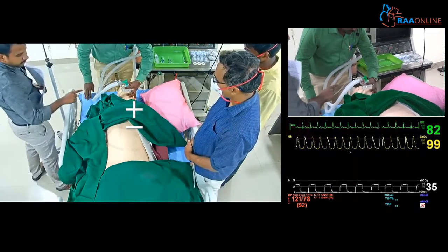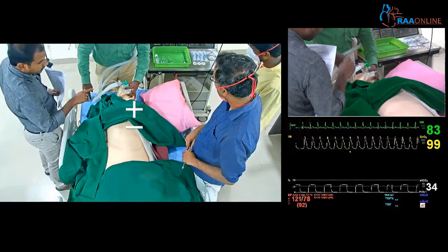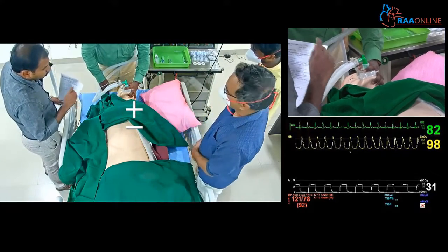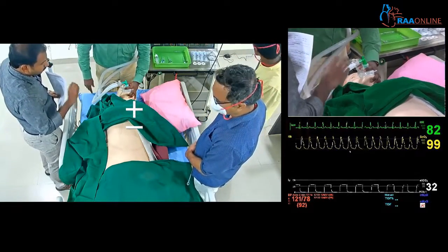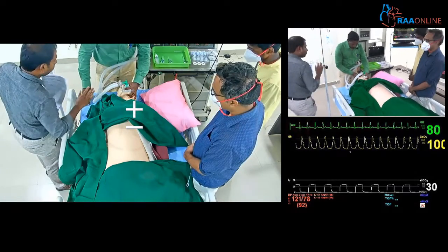I will give fentanyl. I will give propofol. Okay, sir. Fentanyl 2 mcg per kg. Yes, sir. And propofol we will give 2 milligram per kg, total body weight. Okay, sir. So fentanyl given, propofol given. Okay, sir.